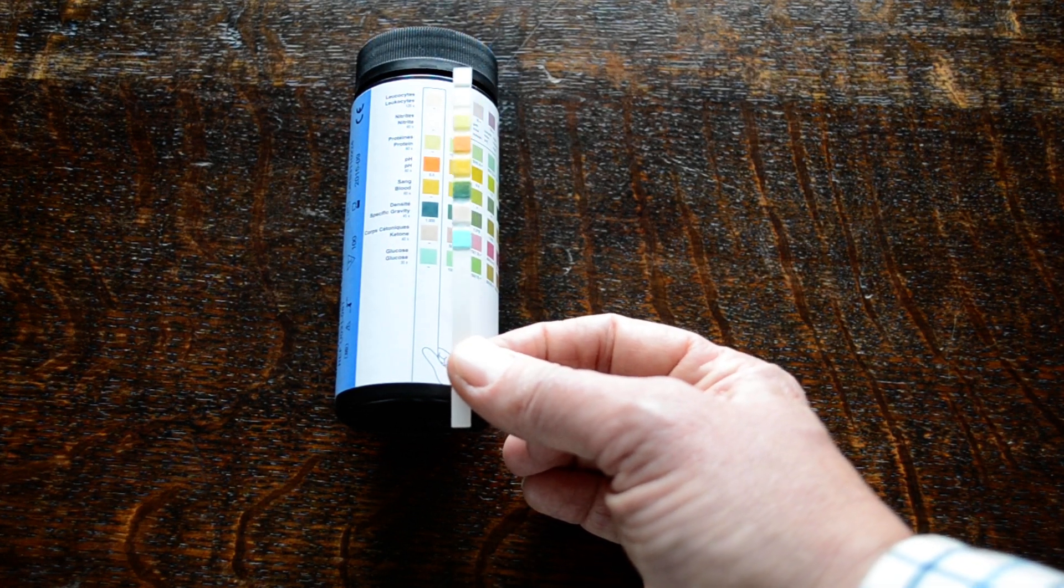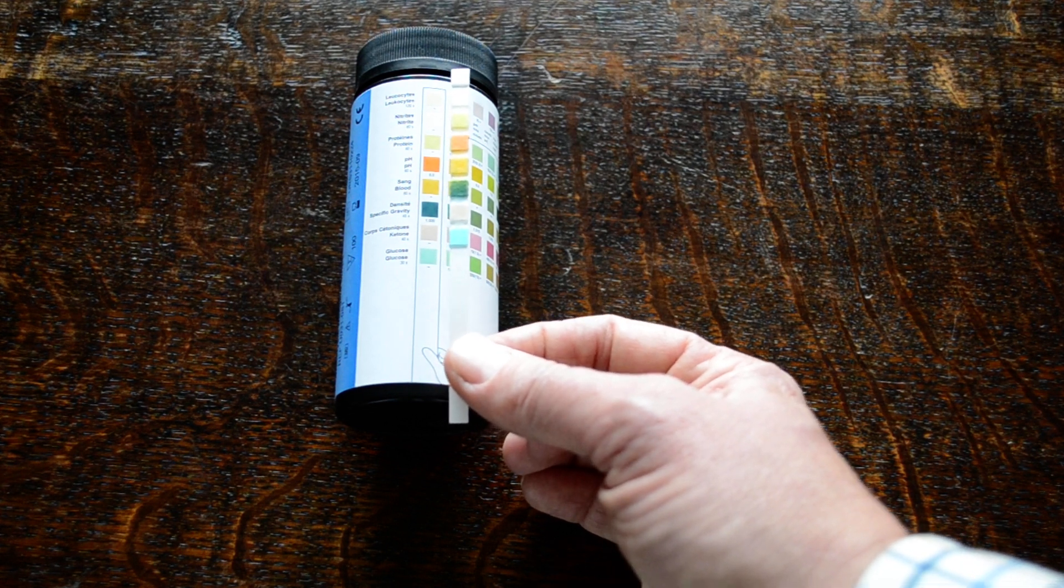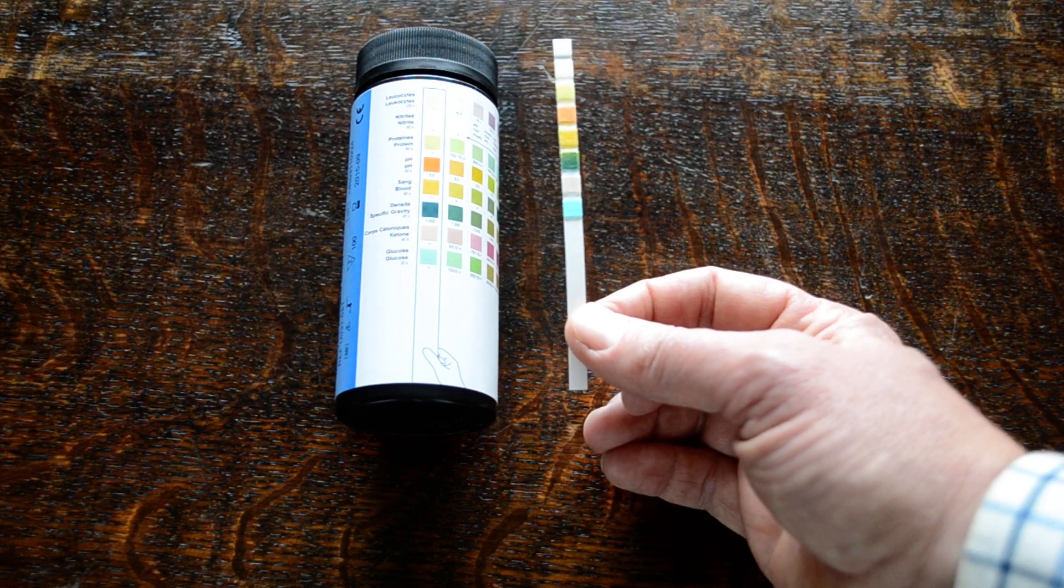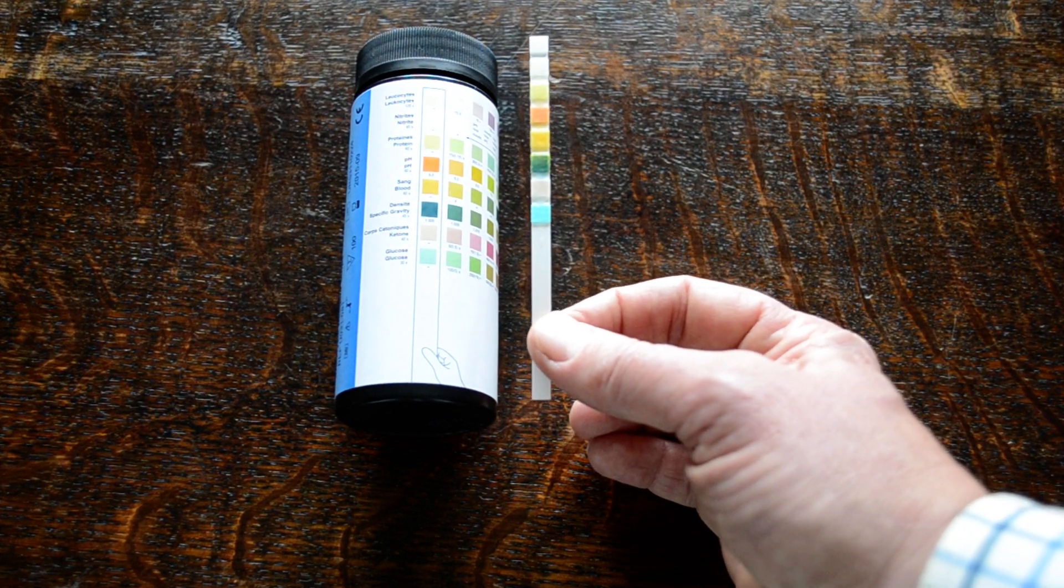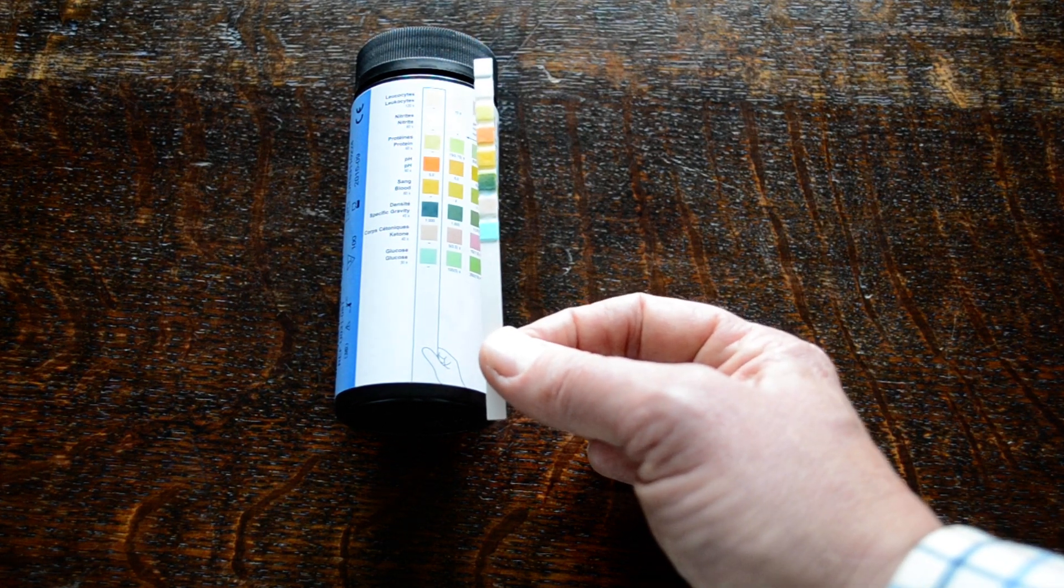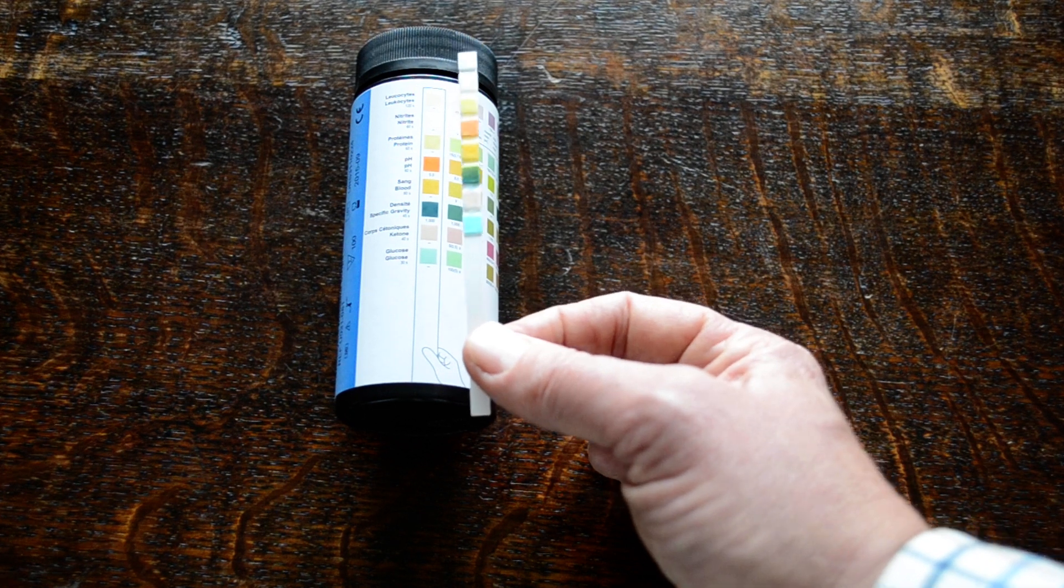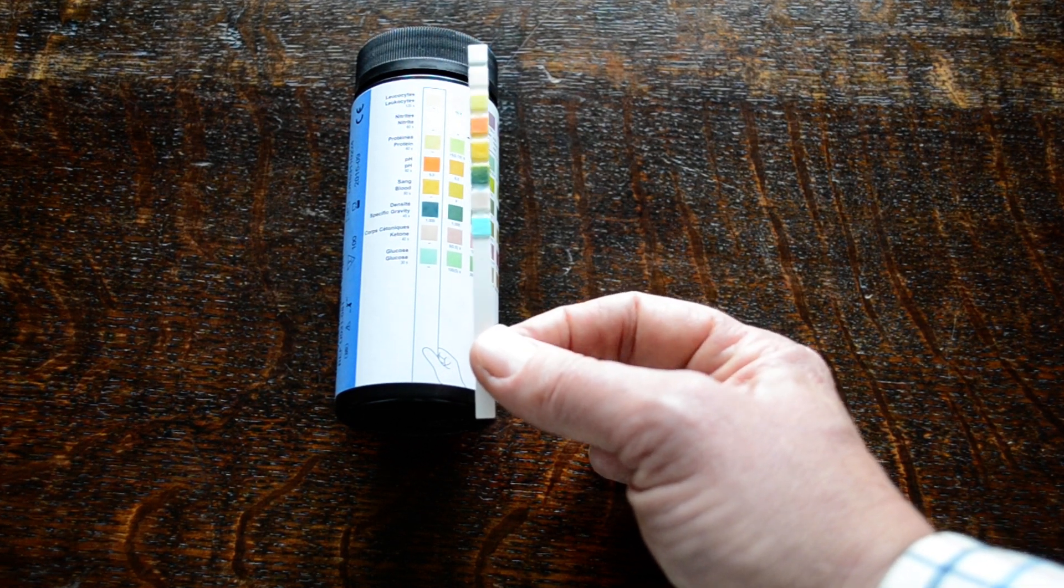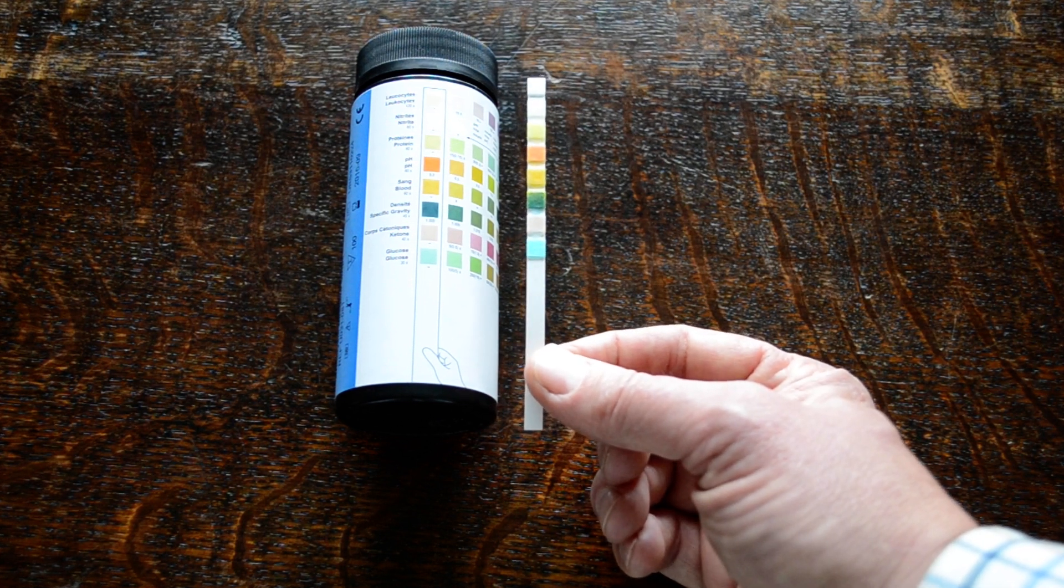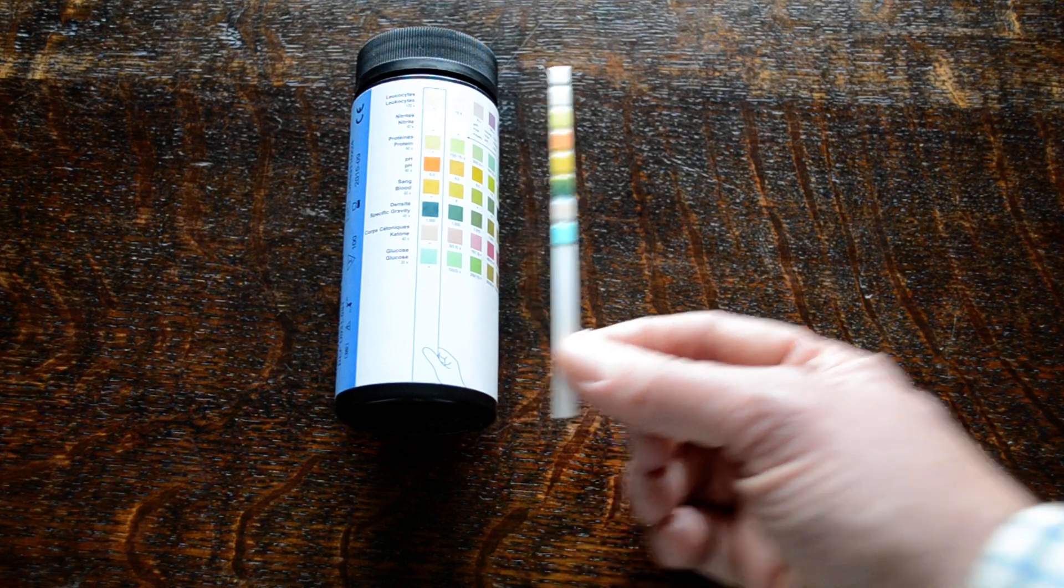As I say, the parameters that you're looking for for cystitis, bladder infections, kidney infections, they're all the same. You're looking for the presence of white cells, high nitrite levels, plus or minus protein, and possibly some blood in a well-going case. So that is how to do a screen using a self-dip test if you suspect the possibility of infection in the renal tract.